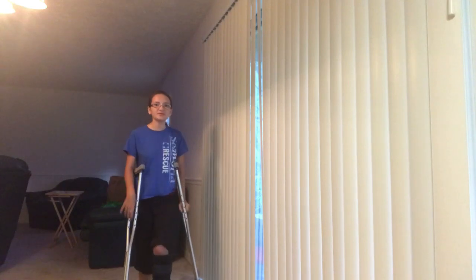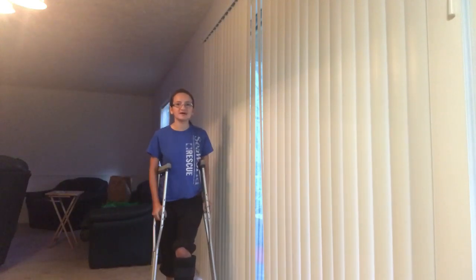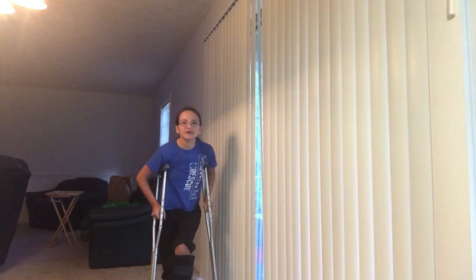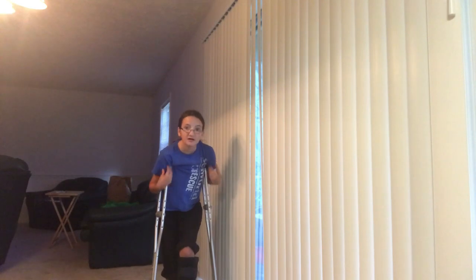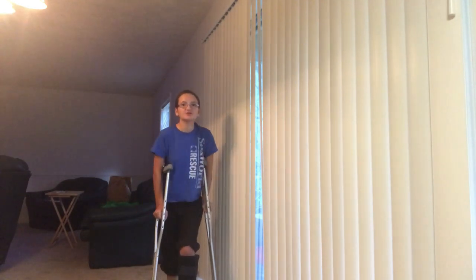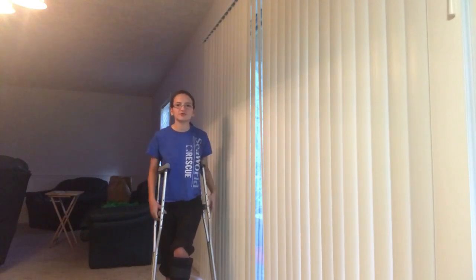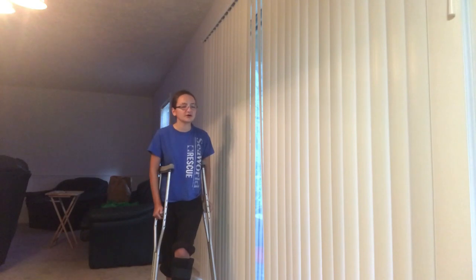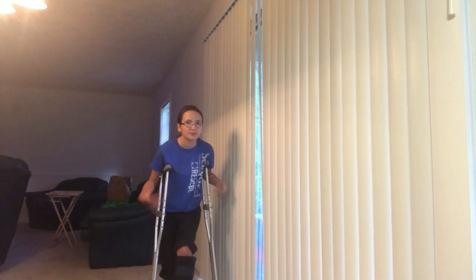Okay, so the first thing I want to talk about is let your forearms take the weight. A lot of people are like this, and they're putting it up on their armpits, but you shouldn't do that, because when you do that, it's going to rub sores under your armpits, and you also have a lot of nerves under here, and so it's just going to get really irritated if you are rubbing it up on your armpits.